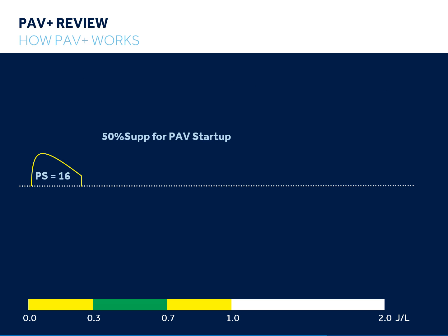In this slide, we'll go over a fairly common clinical presentation you may see when transitioning a patient from pressure support ventilation to proportional assist ventilation. As you can see, the first breath is showing a pressure support breath. We have no indication at this point of patient compliance, resistance, intrinsic PEEP, or work of breathing level.